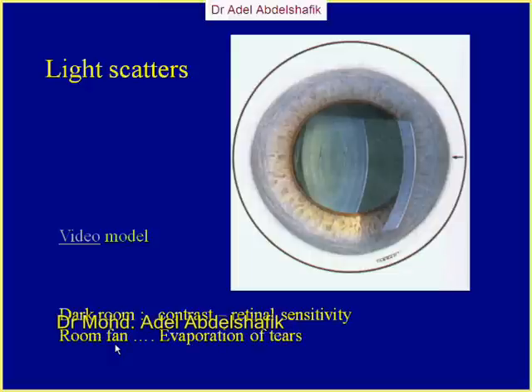Again, avoid using any fan in the room. If there is a fan, there will be rapid evaporation of the tears, and the patient cannot open the eye nicely all the time. So avoid air currents.